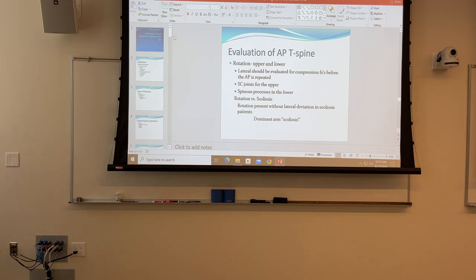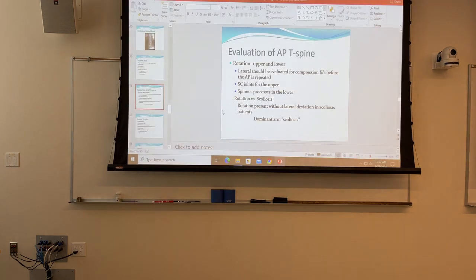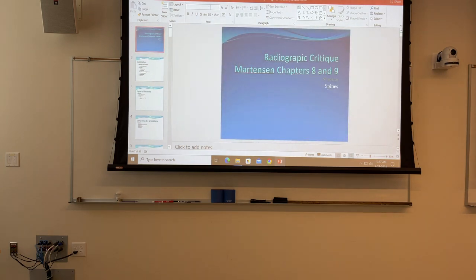I understand that most of your spinal work is going straight to CT now, and that's fine. You may find yourself in a place that doesn't staff CT 24/7, so you may still have to do some spinal work, depending on where you're working.